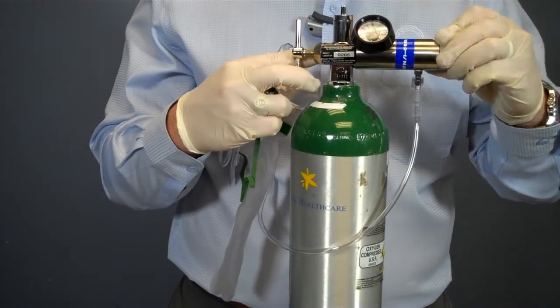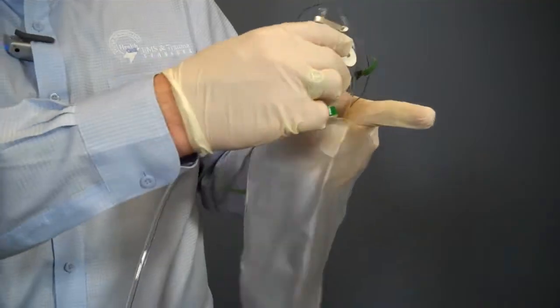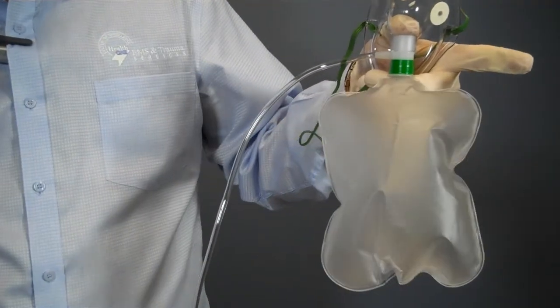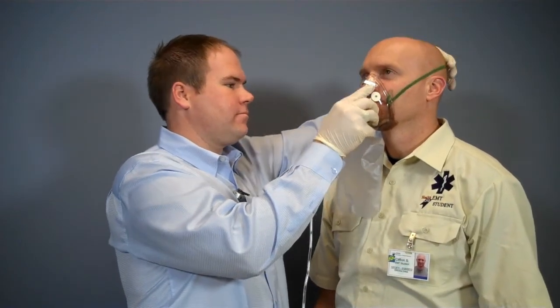I will now adjust the flow to between 10 and 15 liters per minute. Then I place my finger over the valve inside the mask to allow the reservoir to fill. I now place the mask over the patient's face and adjust the straps around their head.